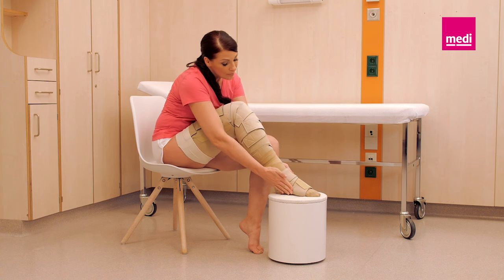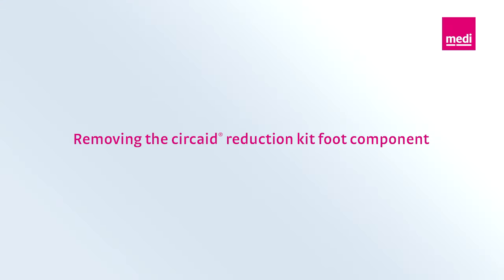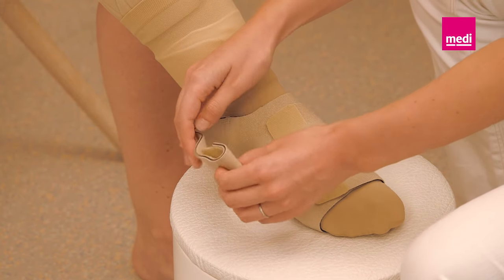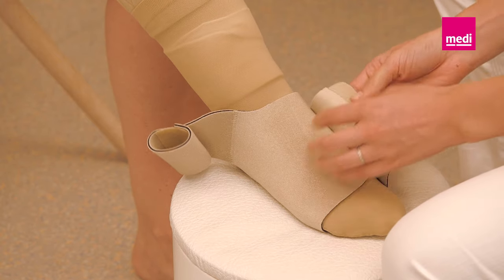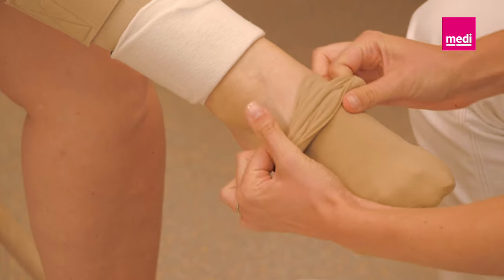To remove the foot wrap, detach the hook tabs and remove the foot wrap from the foot. Roll the straps onto themselves to keep them lint free. Lastly, slide the compression anklet off the leg.